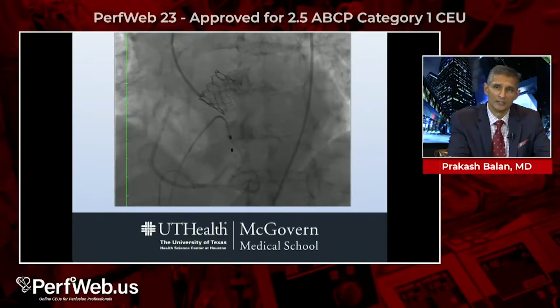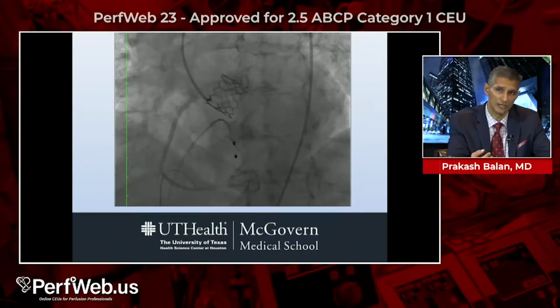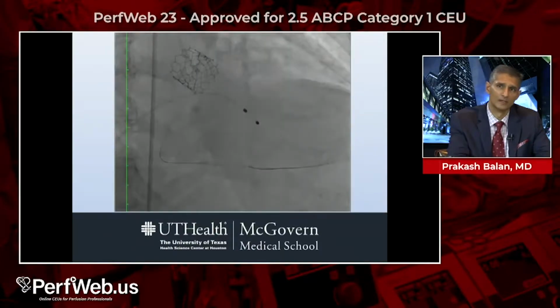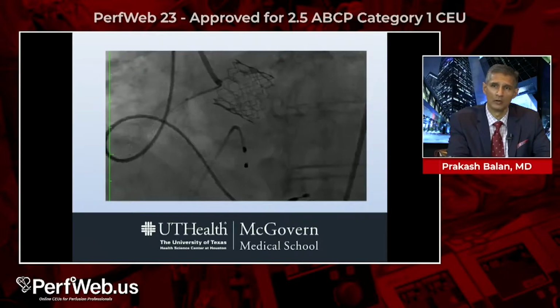And as you can see, something has gone down that proximal right coronary artery. There is clearly a filling defect there. We did look at it by intravascular ultrasound. My suspicion is calcium from the valve itself embolized down the coronary artery. We were able to engage the artery, wire it, balloon, and stent the artery, which did take some time, but we did it all on ECMO support.